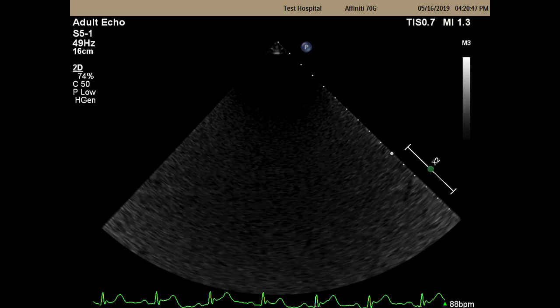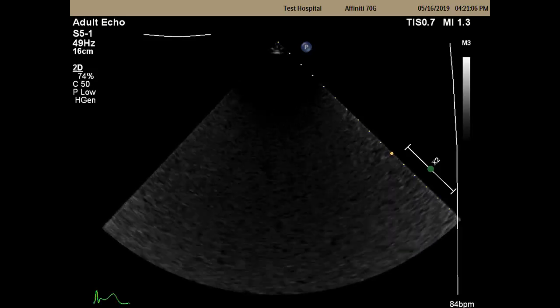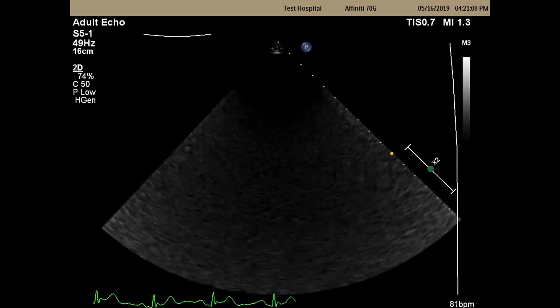And I think from here forward in the presentation, we're really going to focus on only longitudinal strain. As Dr. Sullivan said, the subendocardial fibers are the most sensitive in the heart. So most of the applications of strain have really focused on longitudinal strain, and most of the vendor packages have longitudinal strain on board the system. So that's really where all the money here is in longitudinal strain.